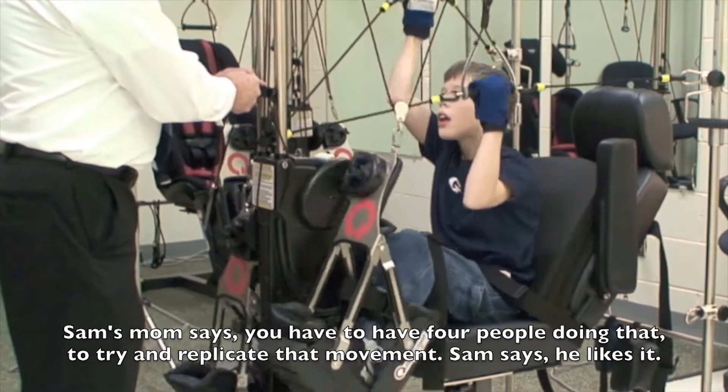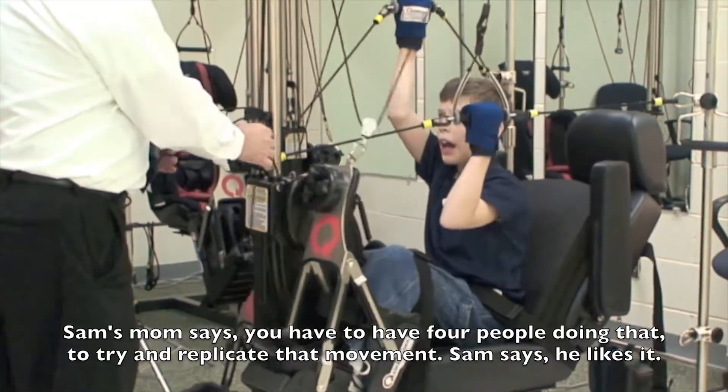You have to have four people doing that to try to replicate that movement.